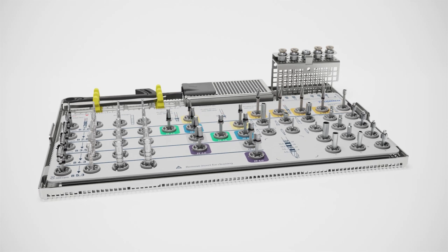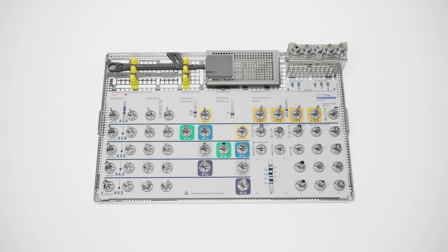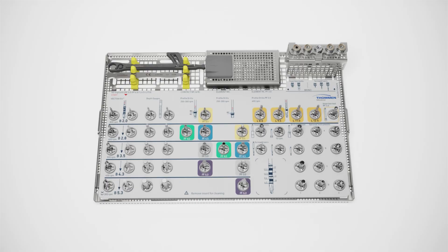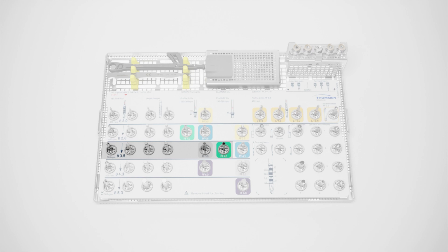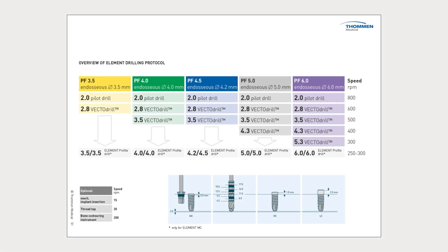During the following drilling instruction, the subcrestal placement of an Element RC implant with a platform size 4 and an endosseous length of 11 millimeters is demonstrated as an example. On the cassette, the platform color indications for both the Element and Contact implant lines guide the user to the necessary drilling diameter. For an Element Platform 4 implant, you will need to reach a drilling diameter of 3.5. You can also use the Drilling Protocol Overview Sheet for guidance.